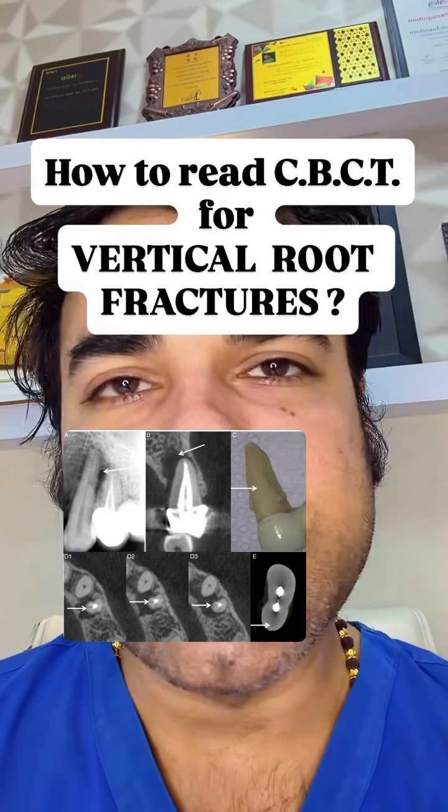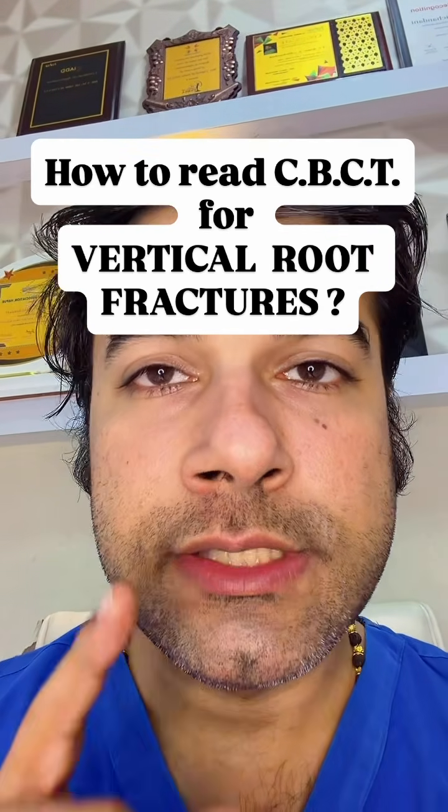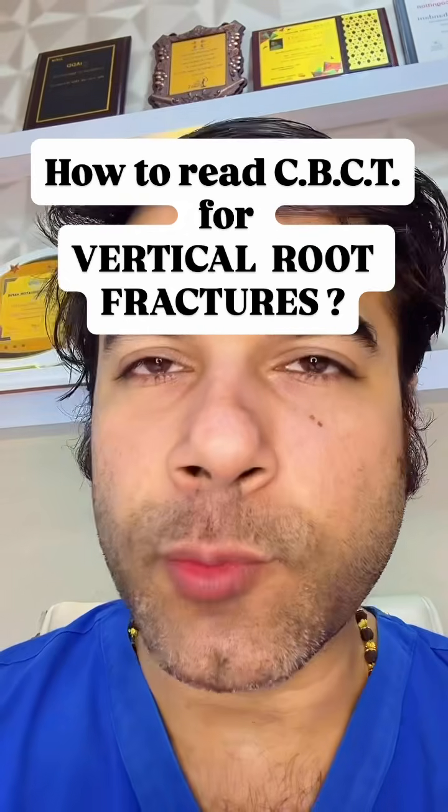How to read CBCT for vertical root fractures? Three people have asked me the same question.